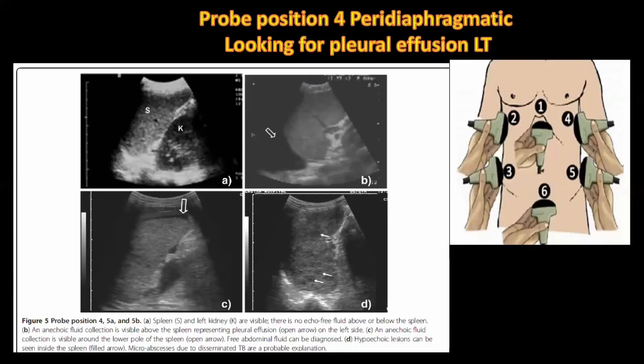And then for position 4, we're going to look peridiaphragmatic on the left. So we're just going to mirror what we did on number 2.